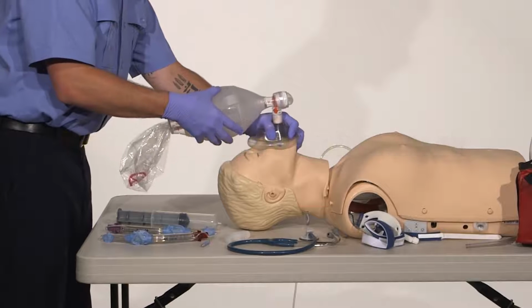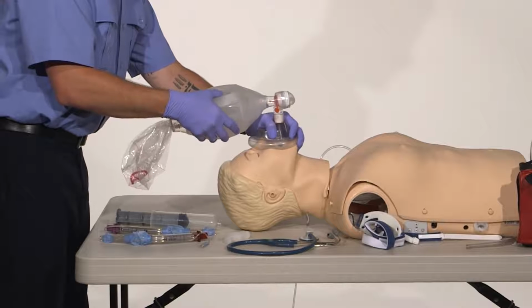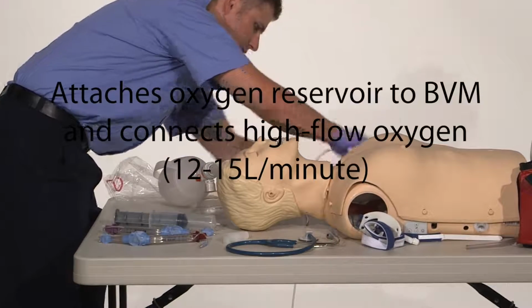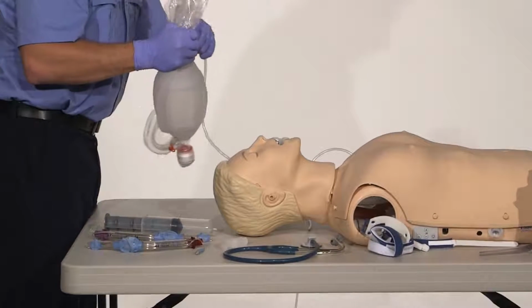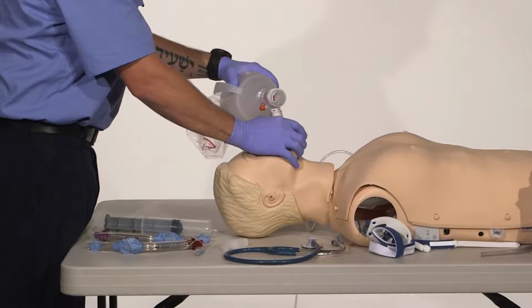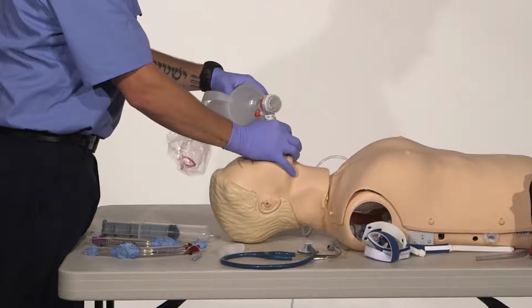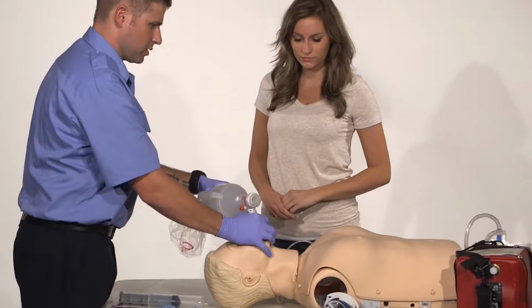Ventilation is being performed without difficulty, but pulse oximetry indicates that the patient's blood oxygen saturation is 85%. Okay, I'm going to place oxygen onto the patient at 15 liters per minute. Connect this onto my bag, and ventilate my patient 10 to 12 breaths per minute. Breath sounds are present and equal bilaterally, and medical direction has ordered insertion of a supraglottic airway.